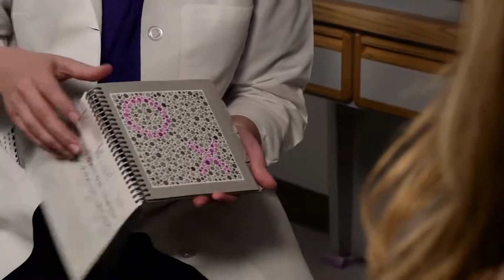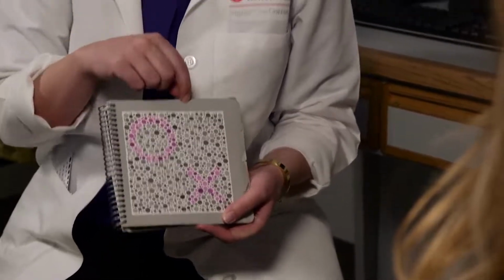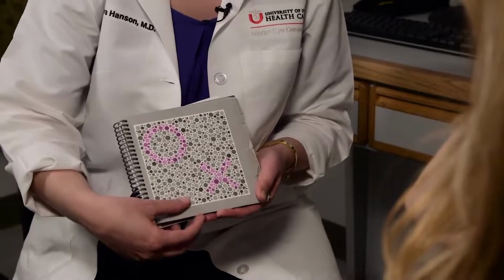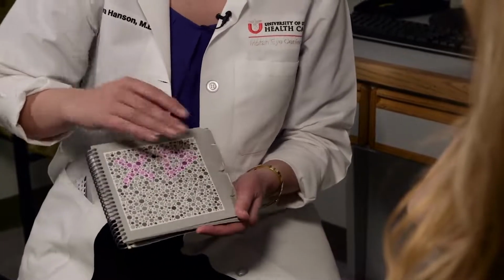Generally, you want to examine patients who have an acuity of around 20/200 or so. The test starts out with 4 different control plates. So you want to have the patient test one eye at a time. So can you go ahead and, yeah, that's perfect. We'll test your left eye first. So you ask the patient to describe what they see on the test plate. X. Good. So you go through all 4 of these.